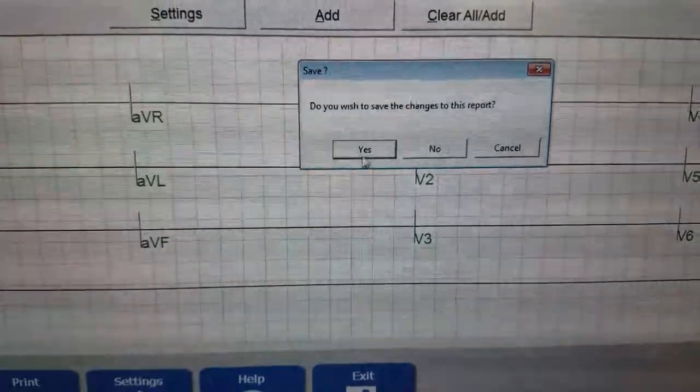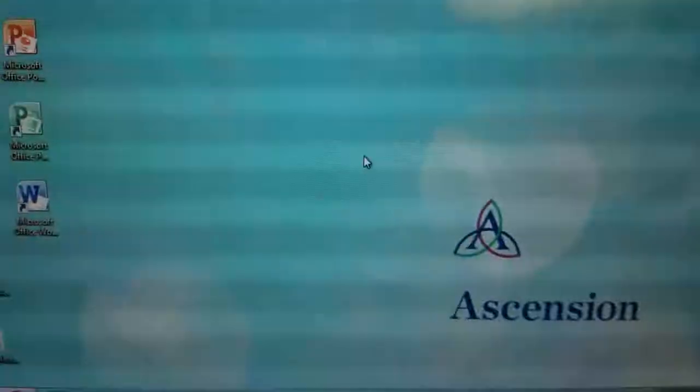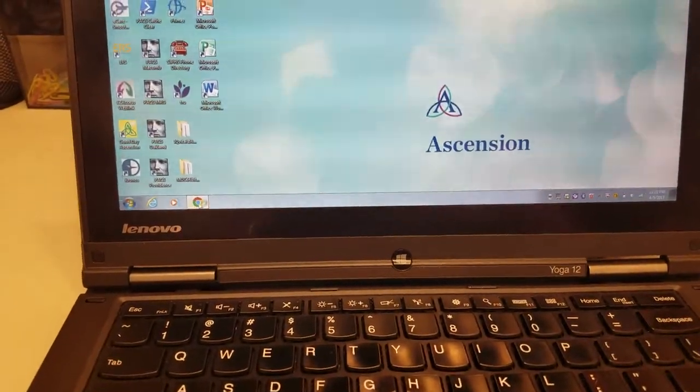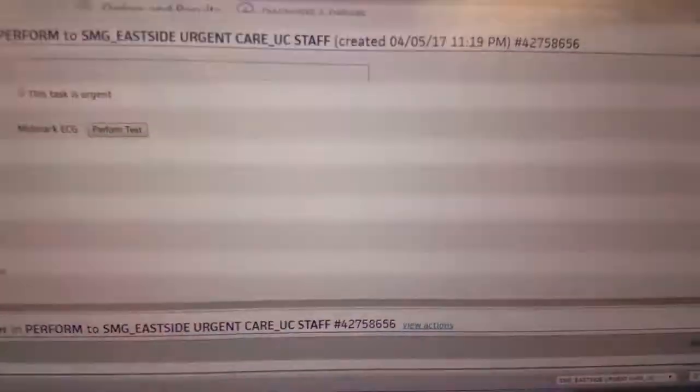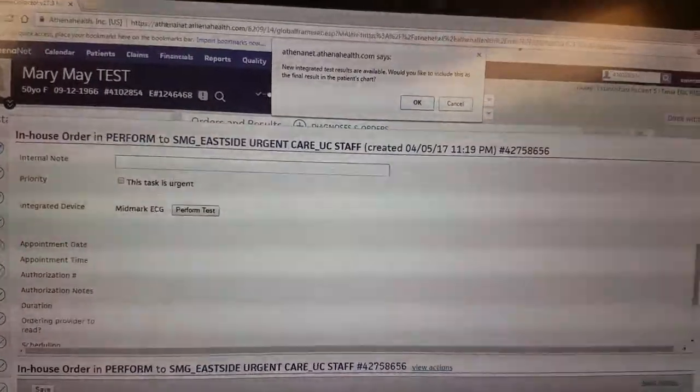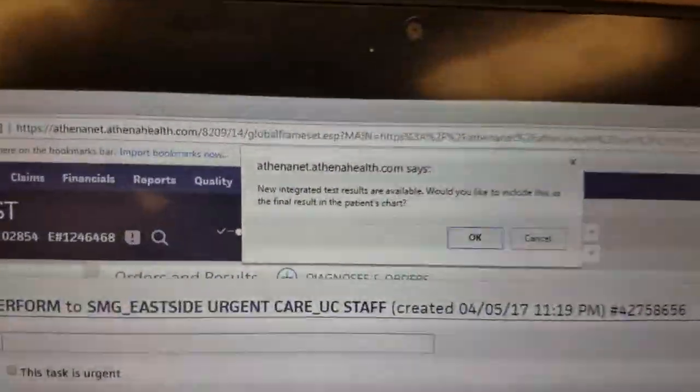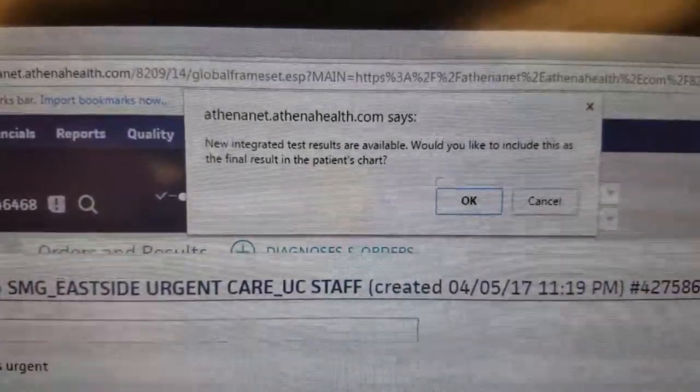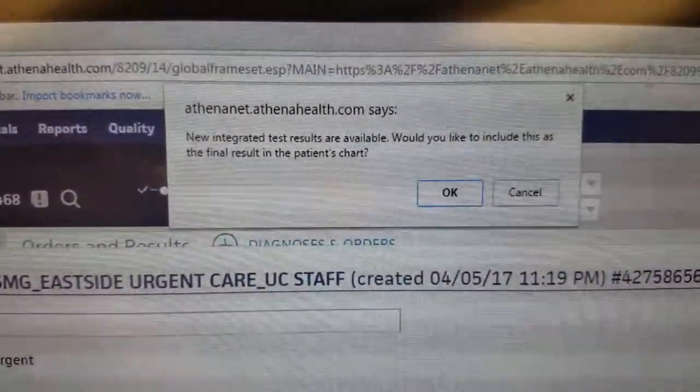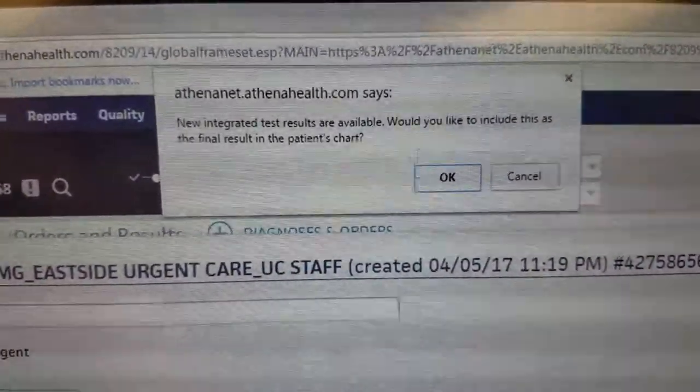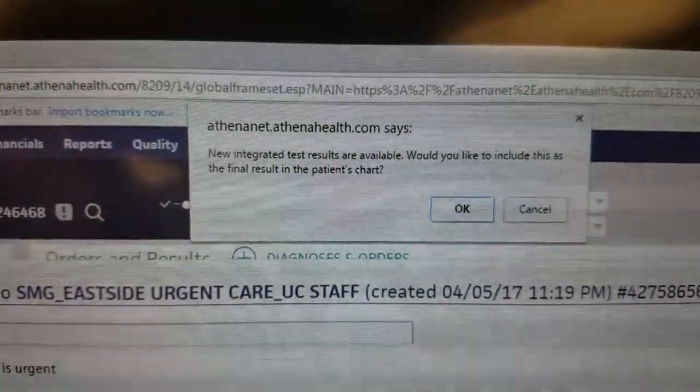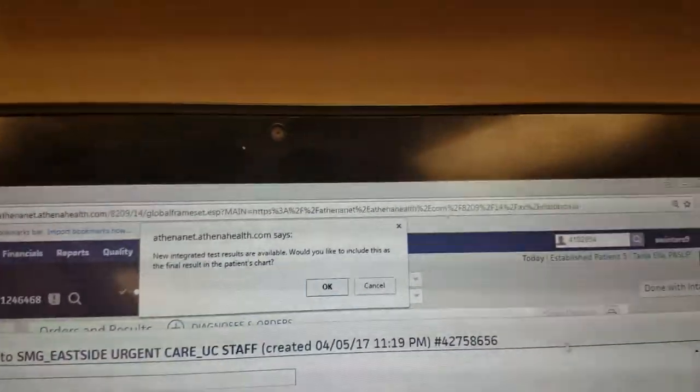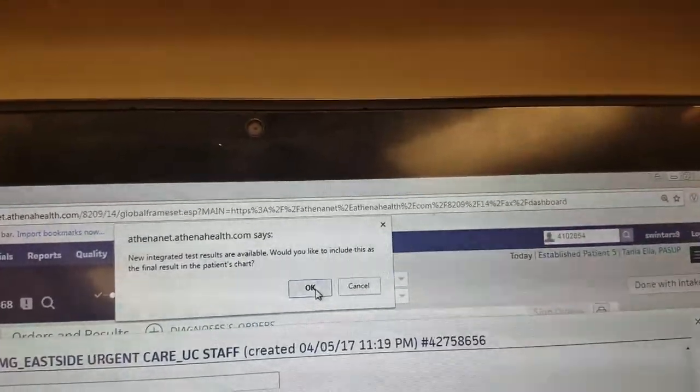Do you wish to save the changes? Yes. So you pop your Athena back up and you wait a second. You're going to hit yes to this. So it wants to know if you want to include the final result in the patient's chart. You hit OK.